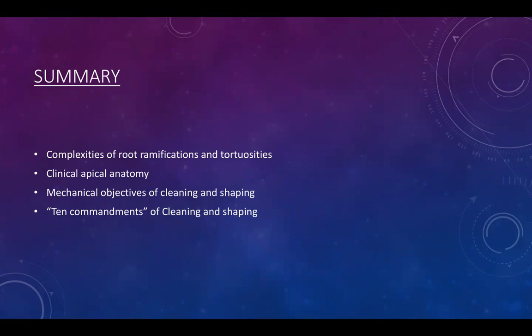But I don't want to get into a lot of things, so I don't know if people have some questions about it, because what I'm trying to say is we're getting to know more now about microbiology, techniques for disinfection, in what cases we can use irrigation, and in what cases it's better to medicate, because by the nature of the case, by the anatomy, by the complication of the anatomy, it might be complicated to achieve the disinfection, and that's what we want.